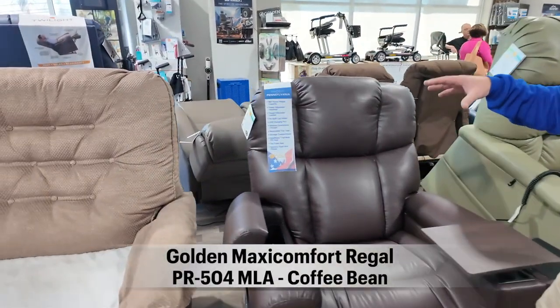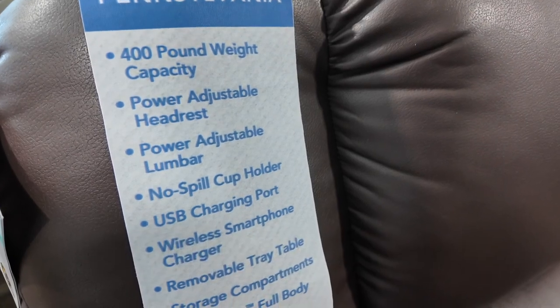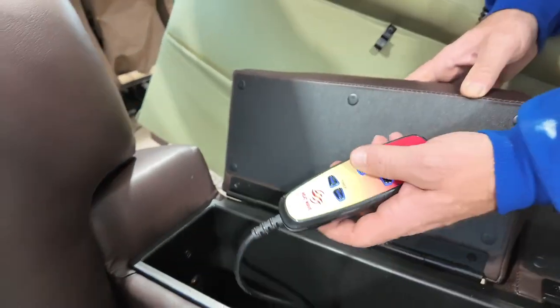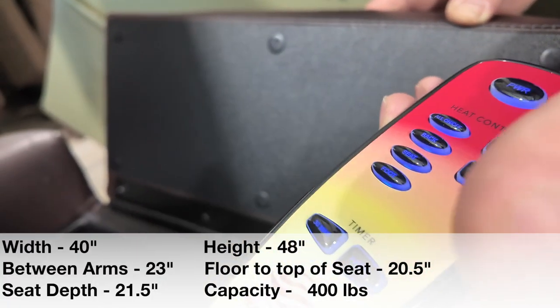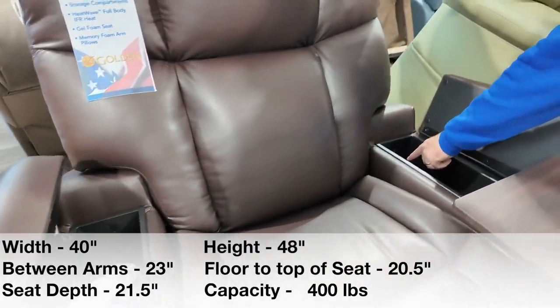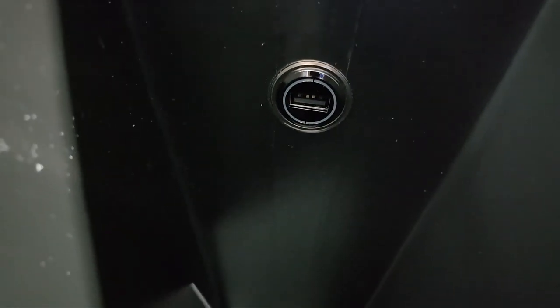This is the PR504 — the new Regal with power pillow lumbar support and compartments for storage. It comes stock with full body heat in the back, in the butt, and even in the foot. It also has a tray, a USB charging port, and a wireless charging port.